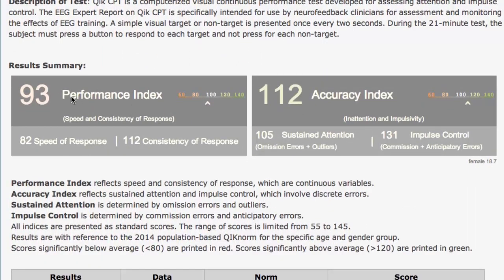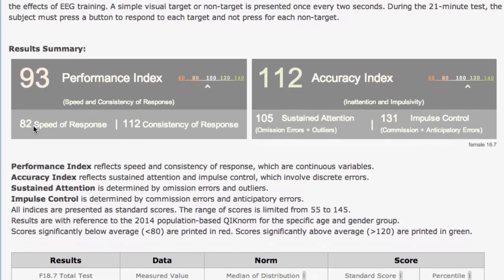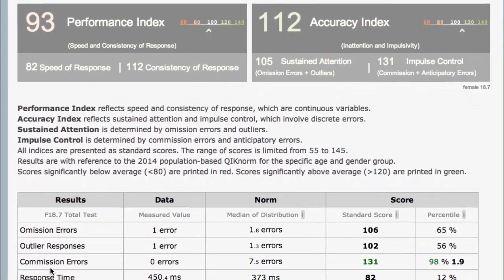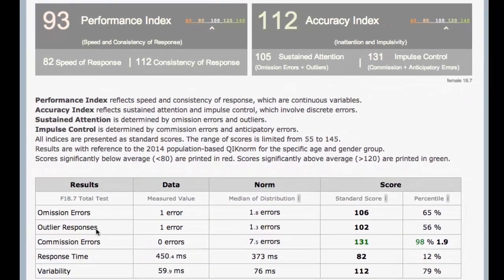We have here this new performance index and accuracy index. So the old numbers that you're used to seeing — like 82 here for speed of response, 112 for consistency of response — these are the old variables that you're used to. Speed of response is reflected down here in these numbers with response time, and 112 for consistency of response is reflected here in variability. These have now been combined into this performance index, which really gives you one solid number — just an index of performance.